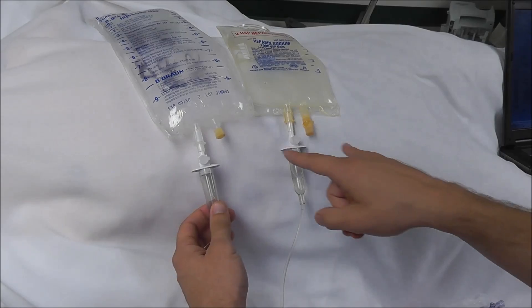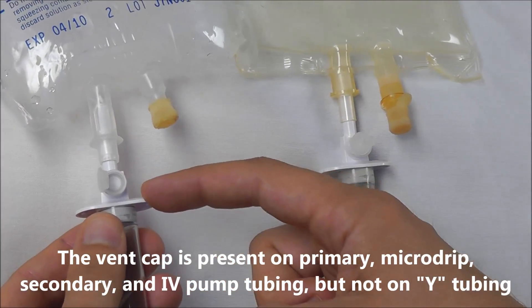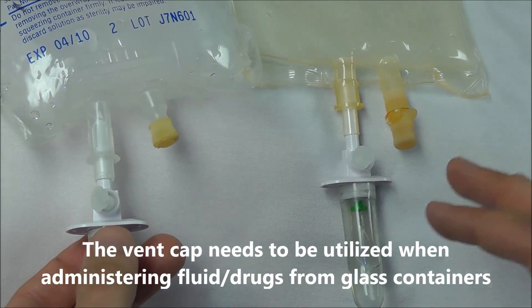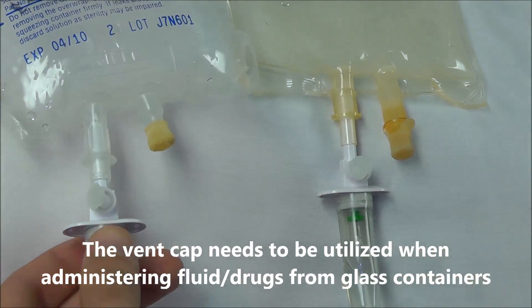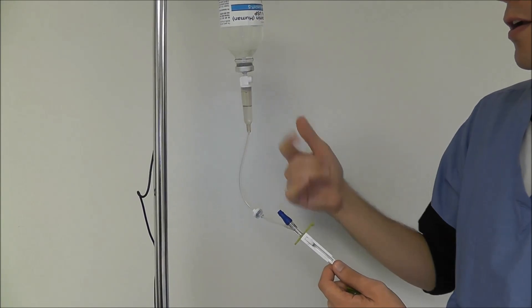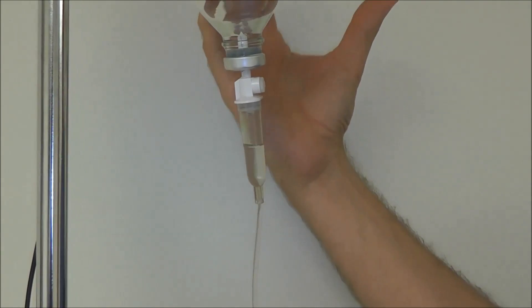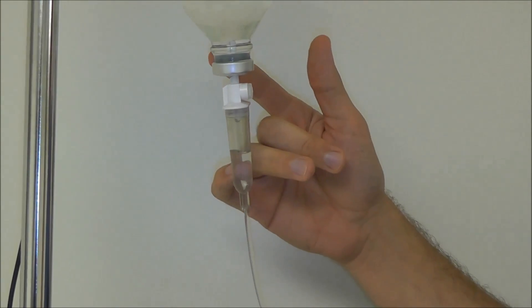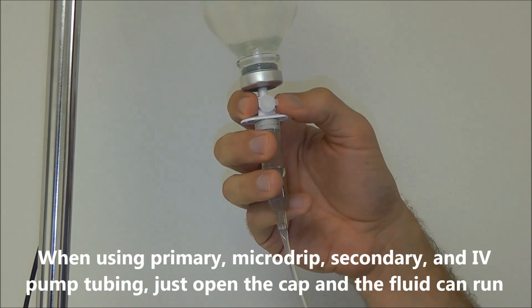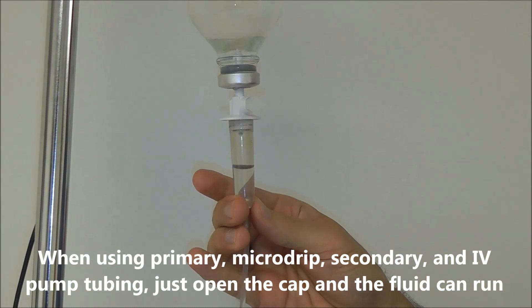The next thing you'll notice on this tubing is a cap that opens the system to the atmosphere. This applies when you're hanging fluid from glass containers. When hanging fluid from a glass container, no fluid runs even though the roller clamp is open, because the glass bottle can't collapse like a regular IV bag. To get it to run, you need to vent the system. With primary and mini drip tubing, all you need to do is open this cap and you'll see the fluid starts running.